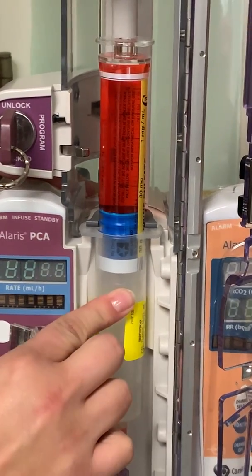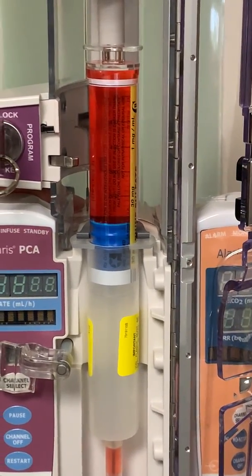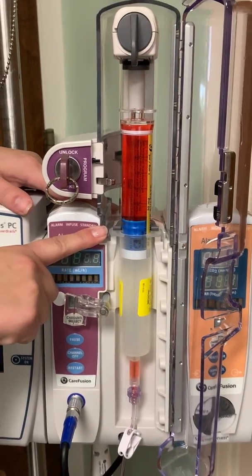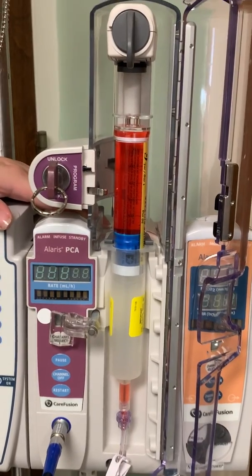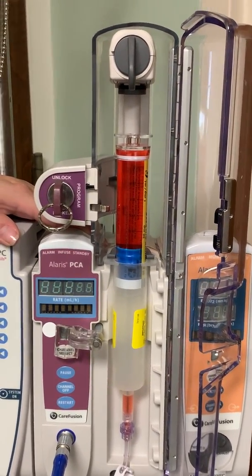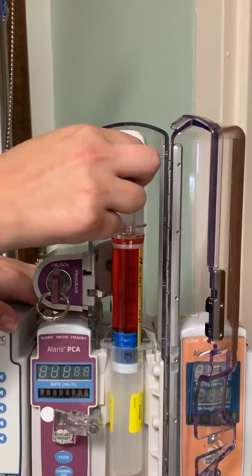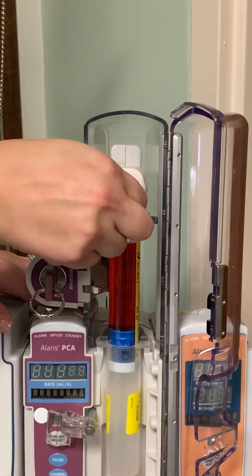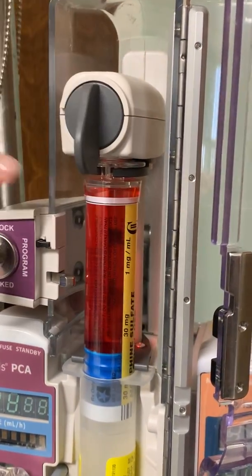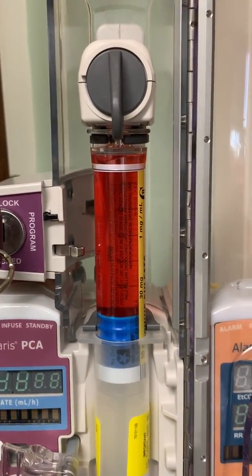That's the first thing you can do. It's in the center, and make sure that's the first. So the center is the first thing you do. Put those flat edges like little wings under the gray piece with the screws. Now once you've done that, you take the gray gripper control that's up at the top, you turn it clockwise and lower that till the grippers rest below the top of the syringe plunger. So it's kind of grabbing the top there. That's the second thing you do.